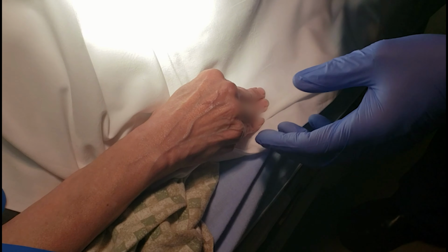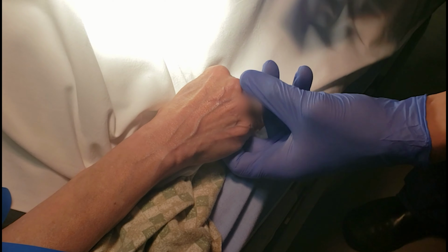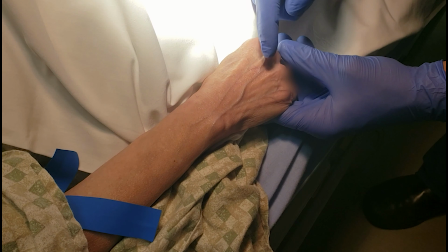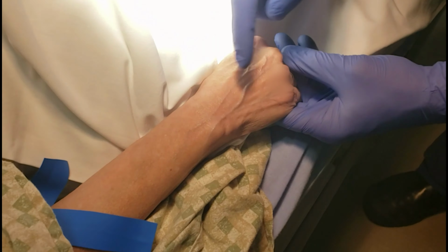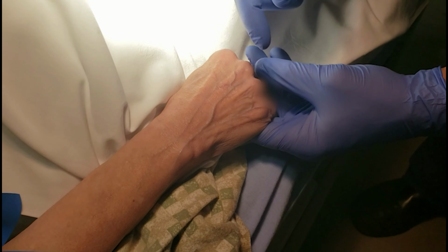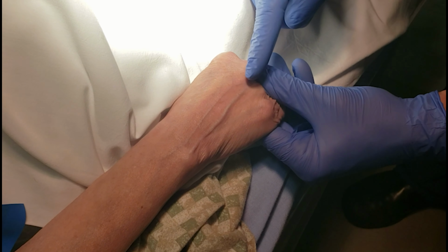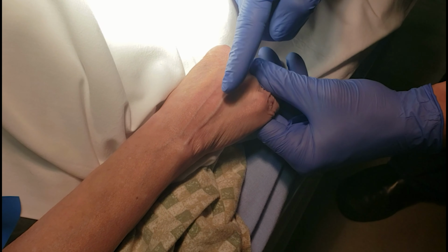All right, so here we're going to do the practical portion. Here we have a tourniquet on. We've sterilized the area. Notice that her veins are a little curvy here, and they're lax. As we talked about, I'm going to pull down here and straighten it out. See how that vein straightens out now? So now it's a smooth shot.